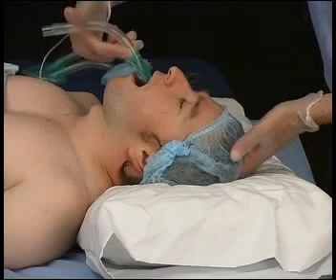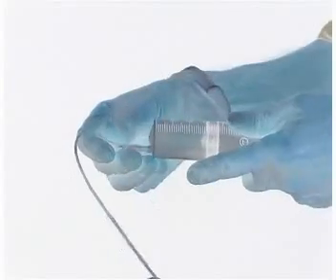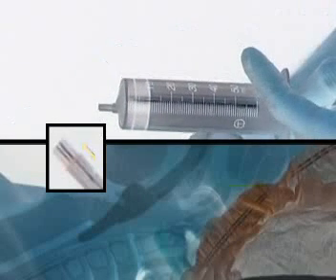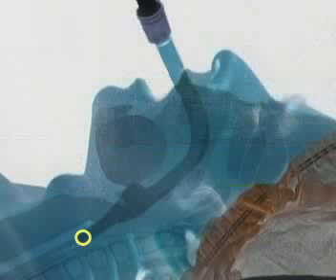So we are ready now to start inserting the laryngeal mask airway. And there you see it, following the natural curvature, with the finger going as far as it can, and then using the other hand to stabilize the laryngeal mask as you remove the introducing finger. Then with a pre-prepared syringe, inflate the correct volume. You will notice that not only is the cuff inflating in the pharyngeal cavity, but the connector is also rising slightly, which is an indicator that the laryngeal mask has been fully inserted.